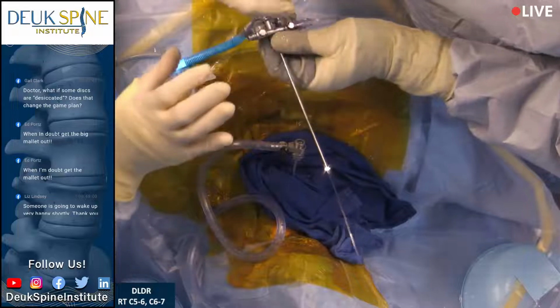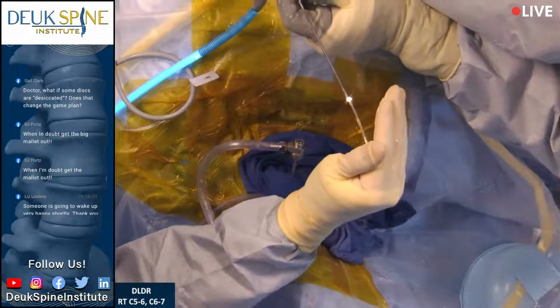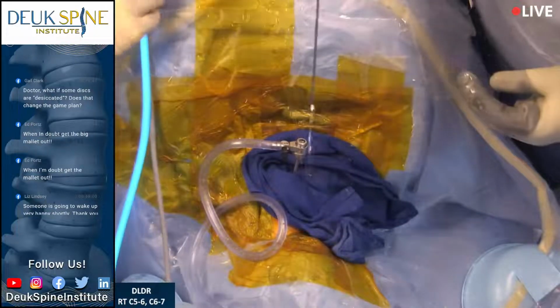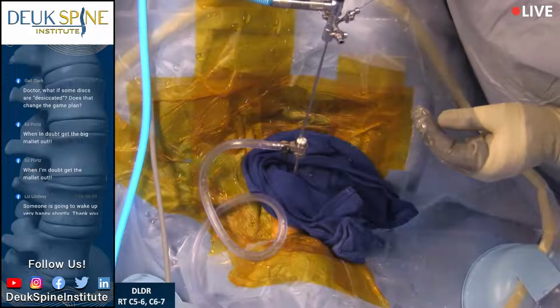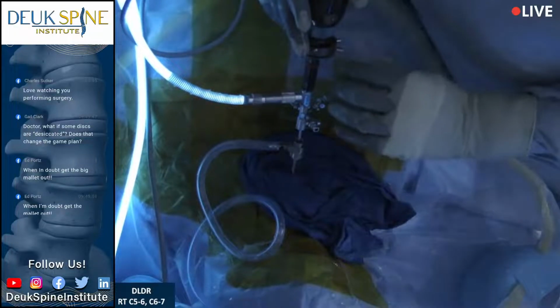Let me do it if you can't do it. What's happening is it's scraping. So I'll leave the valve open. Hopefully that'll give us a little bit better functionality. Scope on. All right.